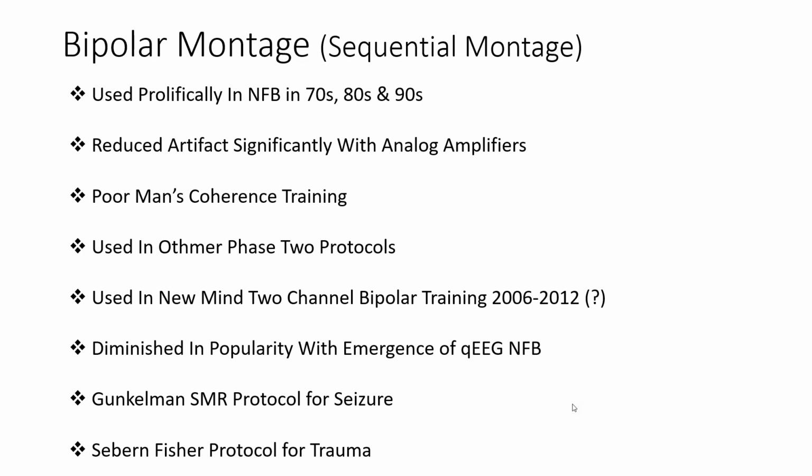There's no reason you have to go afield and use bipolar. It's an option for those who've really kind of mastered monopolar and are looking for something else to explore, or for those who just get up against a wall with a client and want to try something really different. There's typically no danger in doing it or anything like that. It's just that it could cause you confusion unless you're really well established in neurofeedback. So I wouldn't go chasing down bipolar protocols until you spend a year or two doing neurofeedback. If I were you, I think you could get very confused, but I'll leave that up to you.